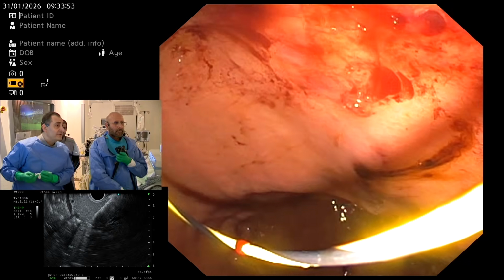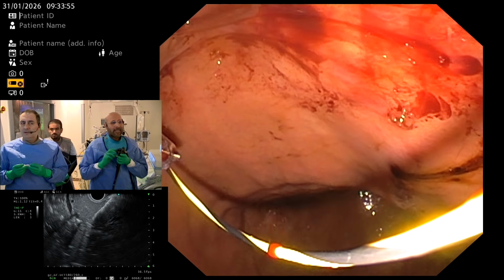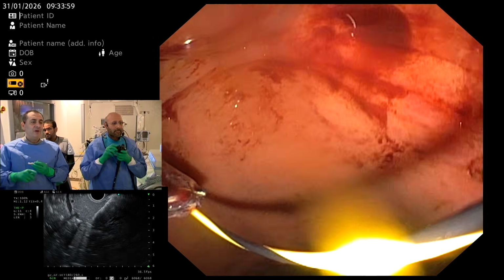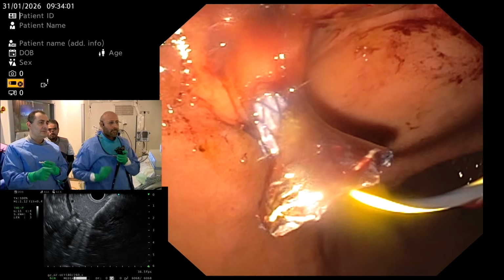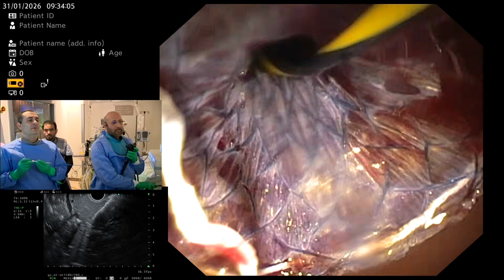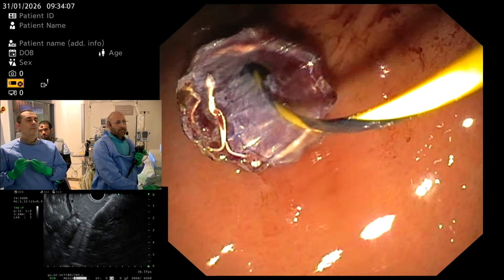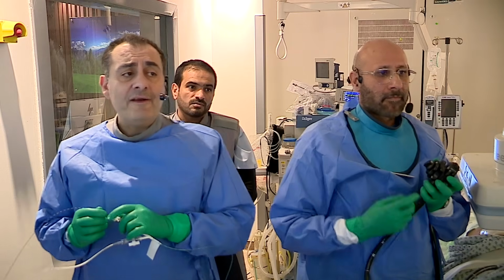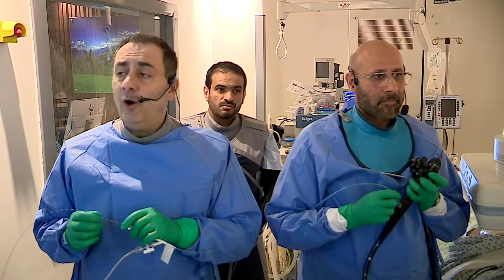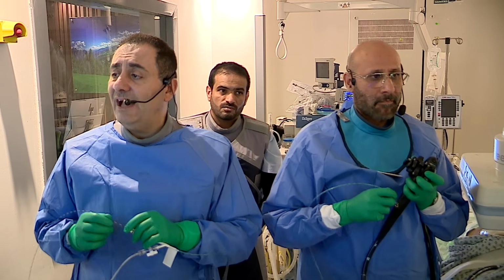Keep the wire. X-ray. No, it is necessary to put... Like this. You have to advance the scope down. So, to my question, voilà. How do you decide the size of the stent? Yeah, so we have removed the inner sheath of the stents, and over the wire now we're going to do dilation. We were able to play with the wire.